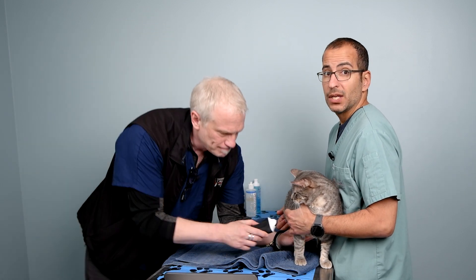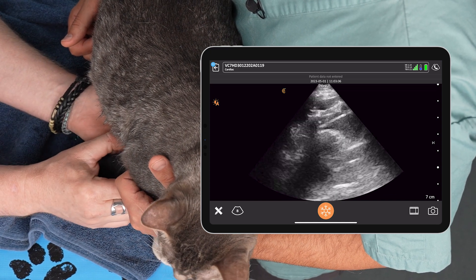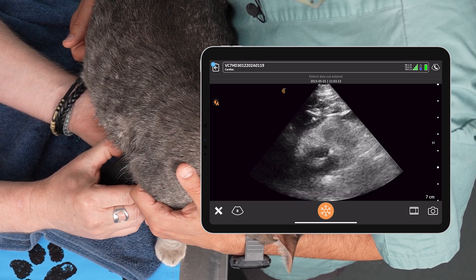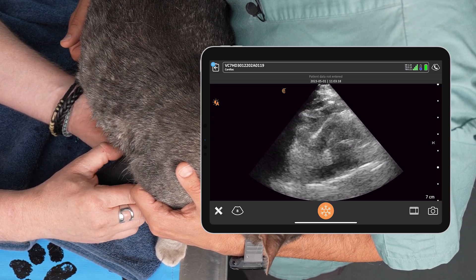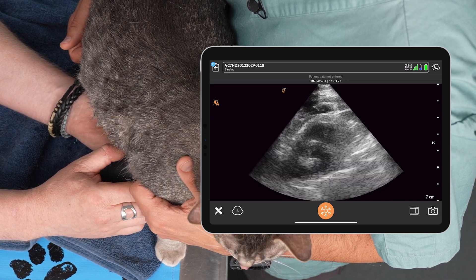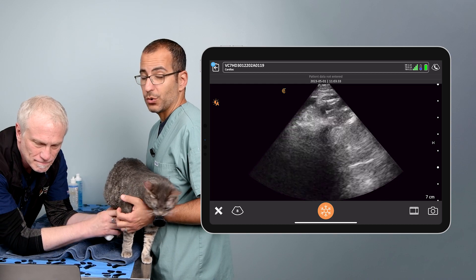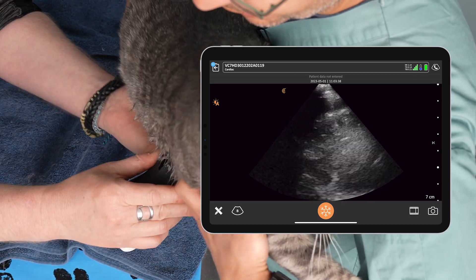You want to position at the xiphoid region, and at that point you're just essentially going to angle the probe — that's it, that's all. There's not much sweeping to do. They have a very small cardiac window in our feline patients. Here you can see I've got the aorta and the left atrium. If I fan down a little bit you get the fish mouth, and further down you'll get the mushroom. Right off the sternum, we put the probe there with the correct orientation — a 45-degree angle to the body.